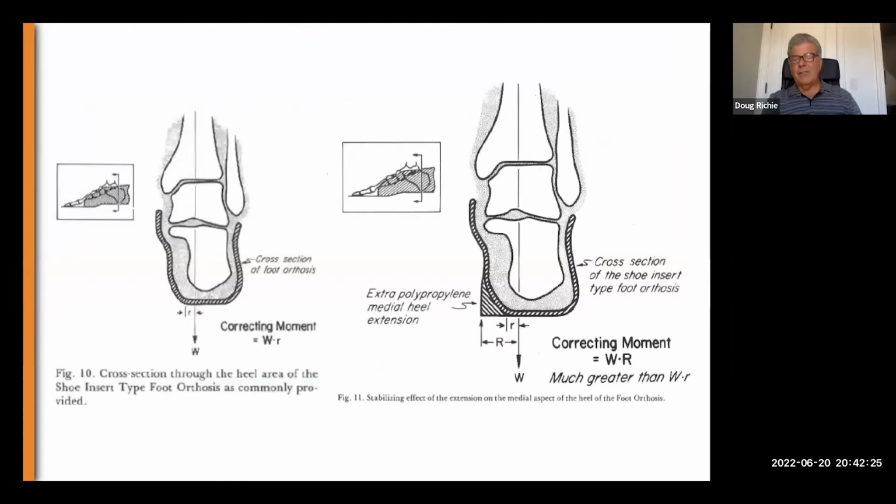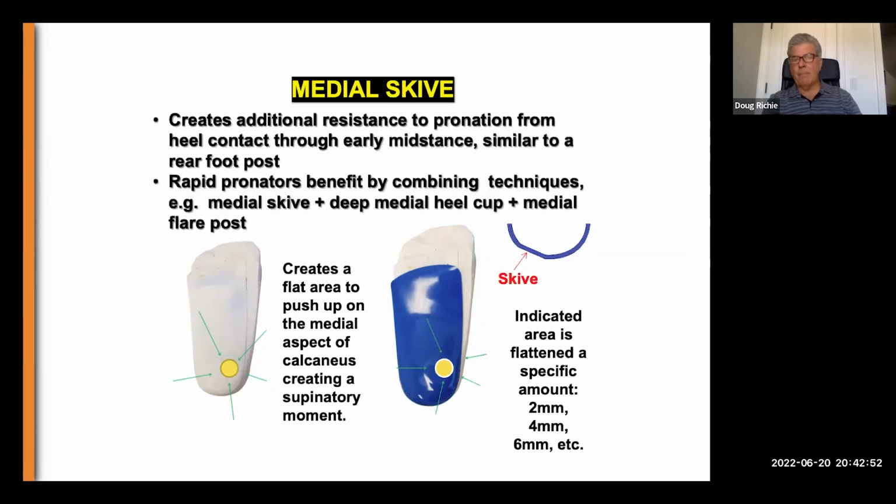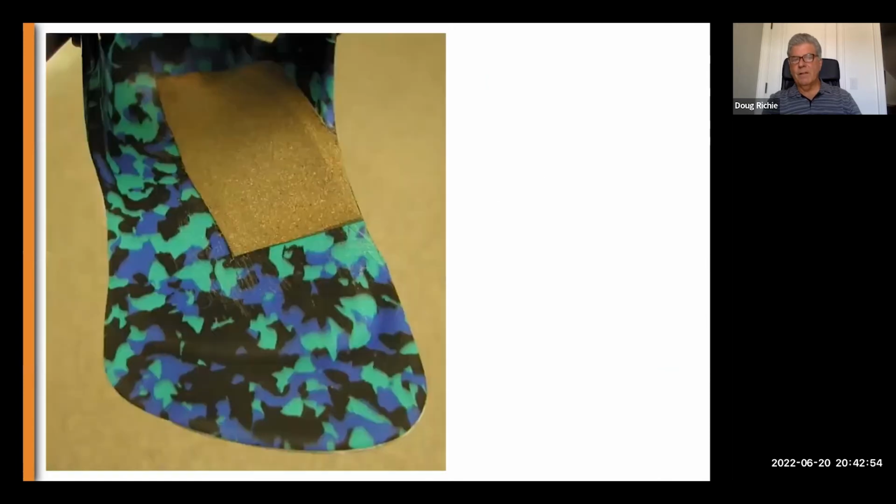We can add additional techniques to the foot plate, as many of you are familiar with the medial skive correction on the positive cast, where we remove plaster on the medial aspect of the heel seat of the cast to induce a varus wedge shape that's transferred to the shape of the foot orthoses to wedge the foot plate and further provide inversion moment to the ankle and subtalar joint. We can wedge the foot plate externally.